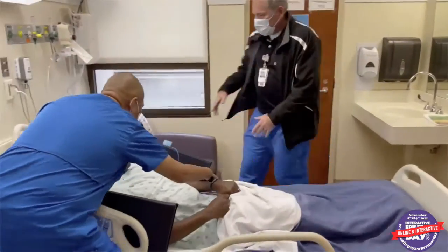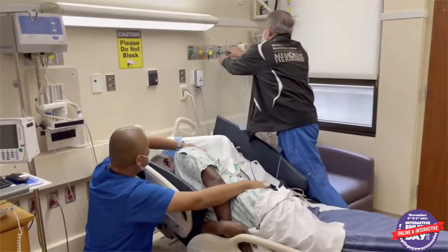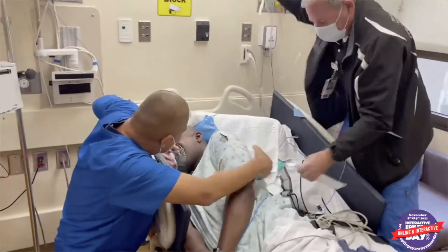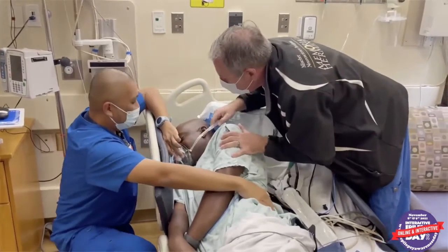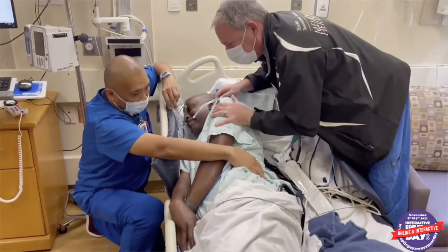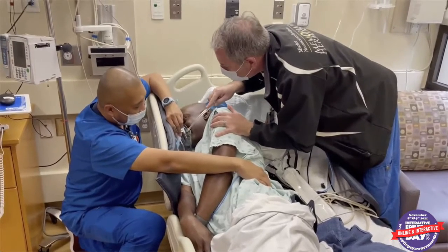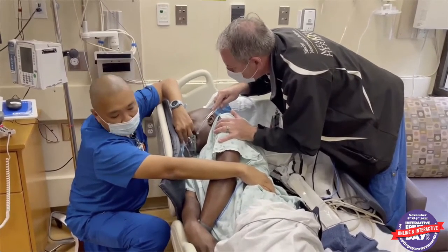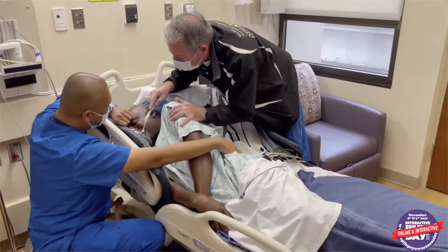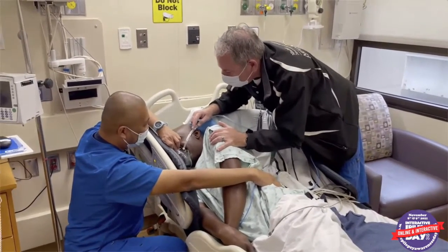All right, he's staring at this point. Okay, Herman, go. Starting, what you see. His eyes are midline. Suction, please. Left leg is shaking. Suction, please. Drooling. Eyes to the right. Hands are flexed. Body is very tense. Tension is more relaxed now. How are we looking back there?